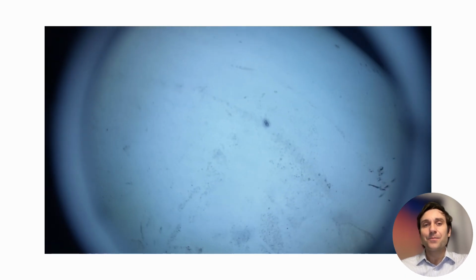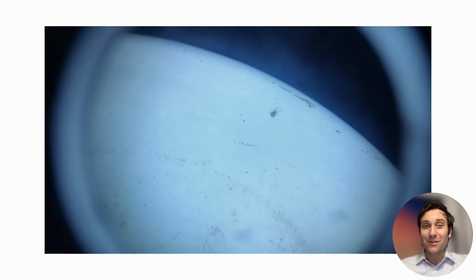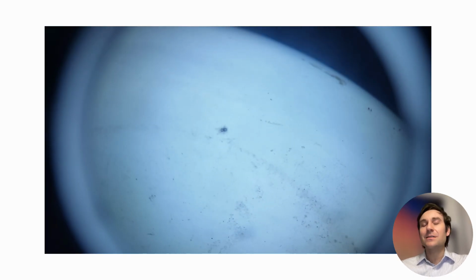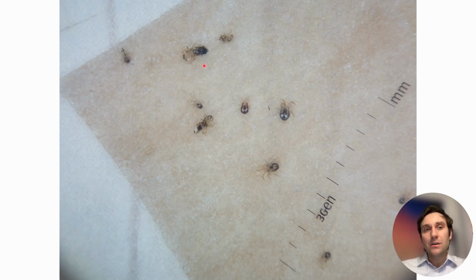But the moment the patient gave me the container, look what was inside. These were not pieces of soil, right? This was a real mite, right? Moving very fast, very quickly. So I picked one of these guys. I picked some of these guys. I put them on a micropore adhesive tape. Look at this. You have here the mites. These small mites with 8 legs here. People have described this as a silver shining mite.